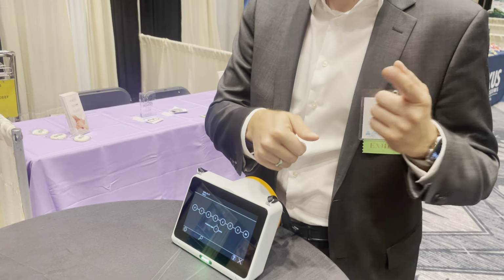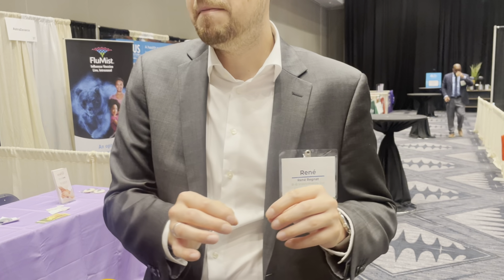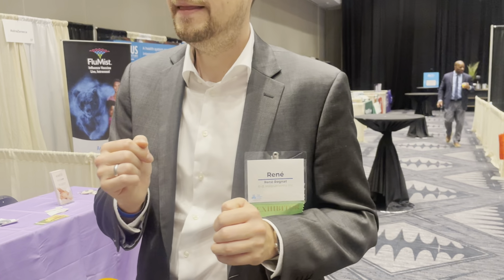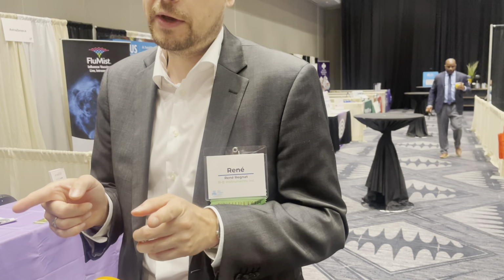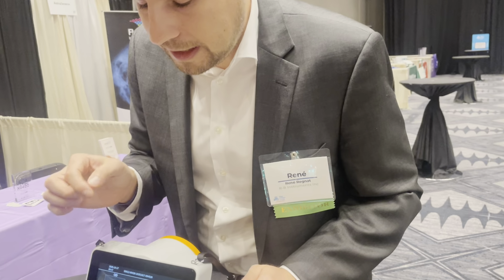The second tap down here, this is where your values are stored. So we show sphere, so the spherical equivalent, this is indicating far-sighted, this is when you see plus values. Short-sighted, this is when you see minus values. And then you can see the difference between both eyes, anisometropia. The second line, cylinder, this is astigmatism.